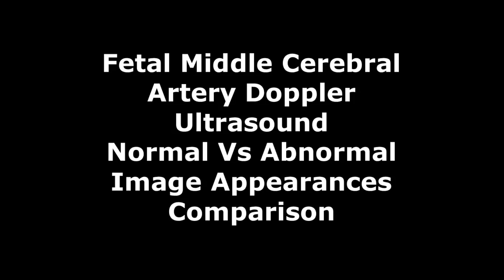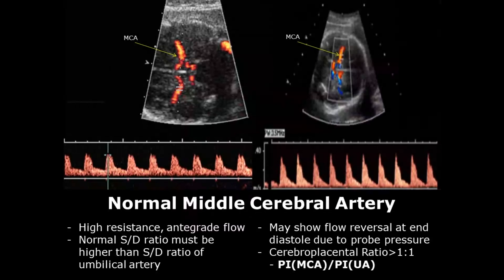Hello everyone, this is Dr. Sam. Today we will study Doppler ultrasound of the fetal middle cerebral artery. On spectral Doppler there is high-resistance antegrade flow — antegrade meaning forward flow. We can see the high-resistance flow by looking at the velocity; the end-diastolic velocity is very low, less than 10 centimeters per second.